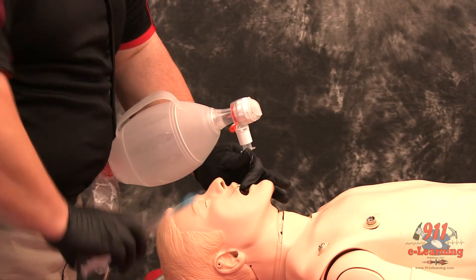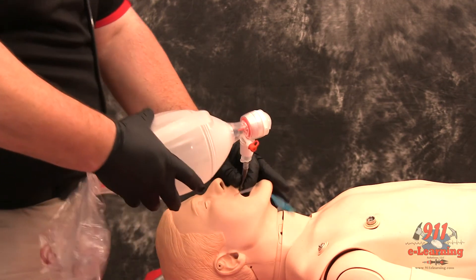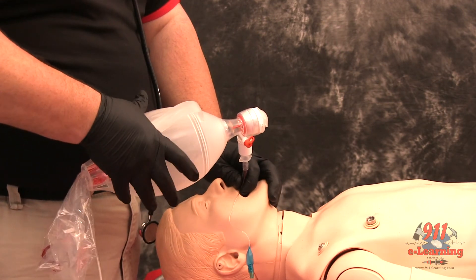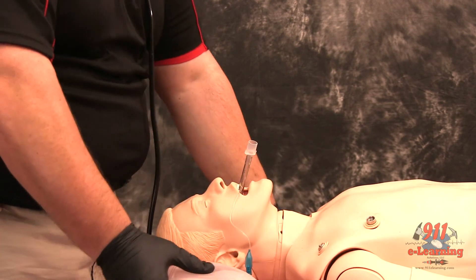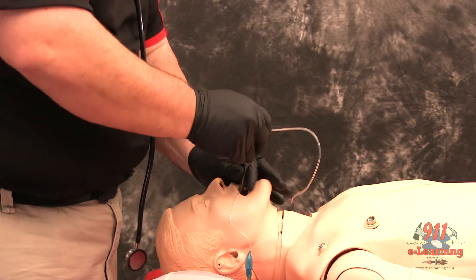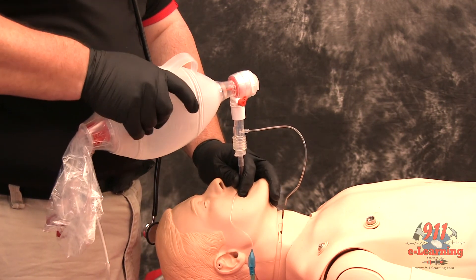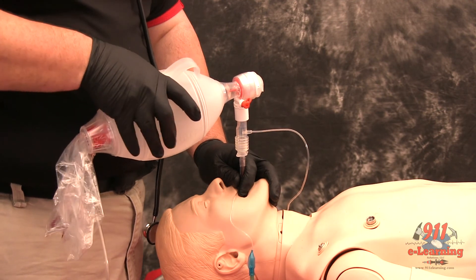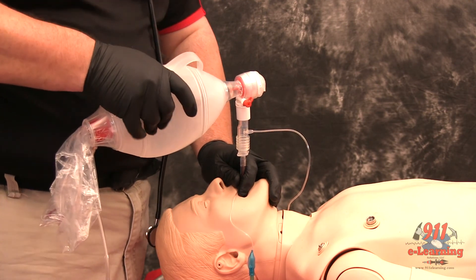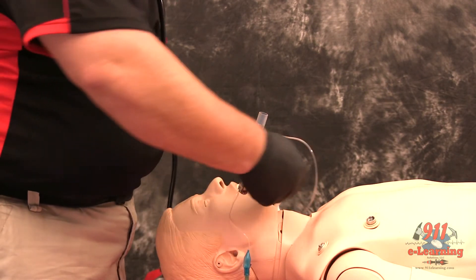Inflate the cuff with 3 to 10 cc's of air. Apply an end-tidal CO2 monitor and record and monitor readings to assure continued tracheal intubation. When final position is determined, secure the ET tube.